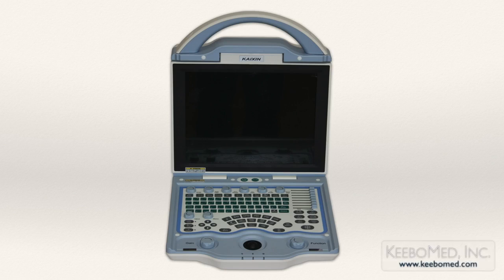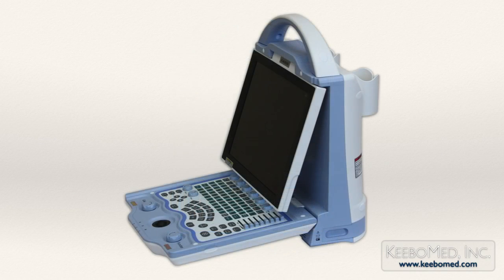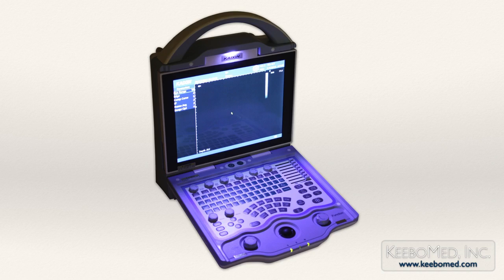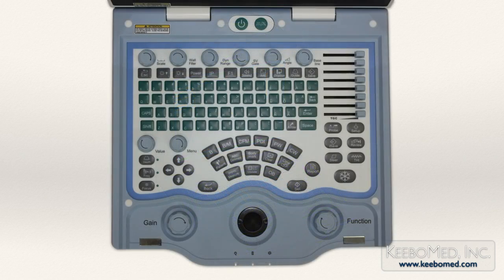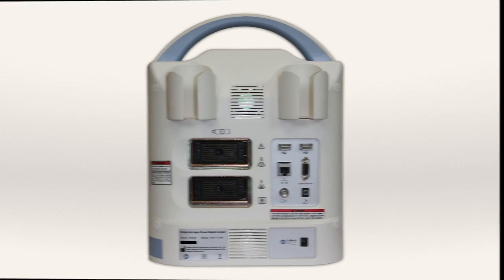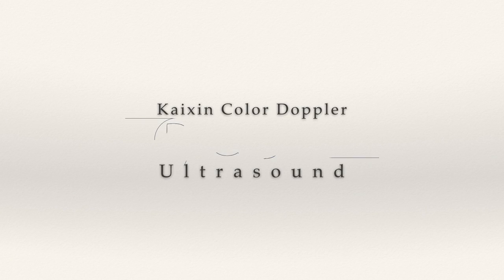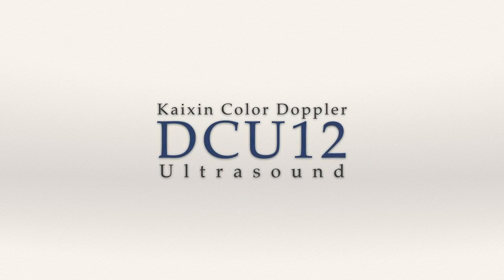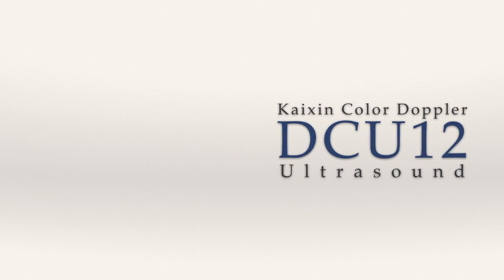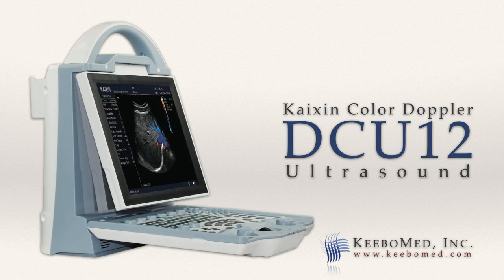The DCU-12 color Doppler ultrasound has proven to be a perfect choice for many because of its high quality, extensive features, and affordable price. It also includes a 2-year warranty. For additional information or to purchase the DCU-12 color Doppler ultrasound, visit our website at kibomed.com.